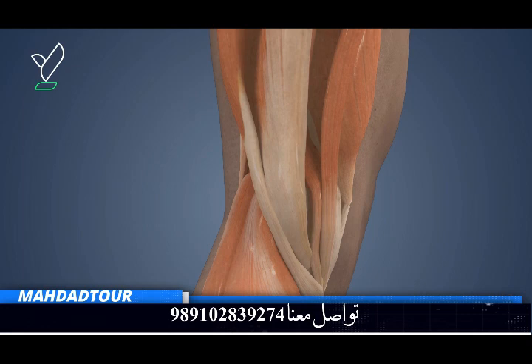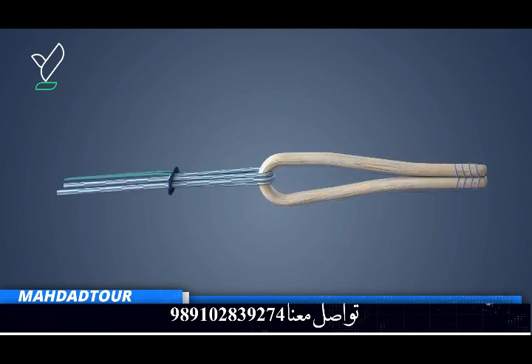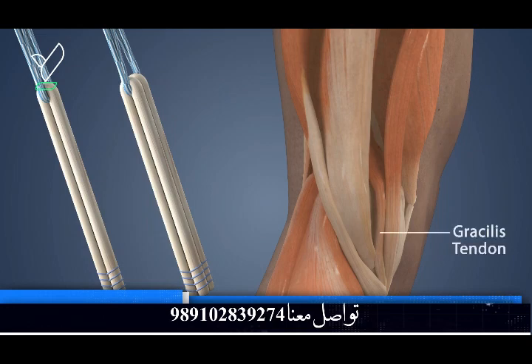During your reconstruction procedure, the surgeon will harvest the semitendinosus hamstring tendon, which runs across the inner side of your thigh and knee, and fold it to create a two-strand tendon graft. The hamstring graft is reinforced with sutures. In addition, suture material is threaded through a tiny metal plate, which will anchor the graft following placement. In some cases, the surgeon may also harvest a portion of the nearby gracilis tendon to create a four-strand tendon graft.